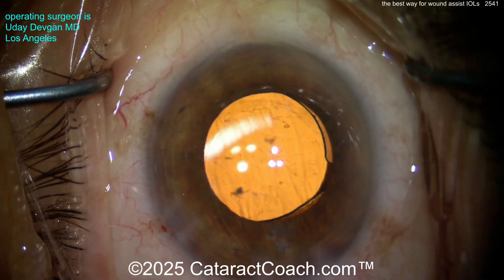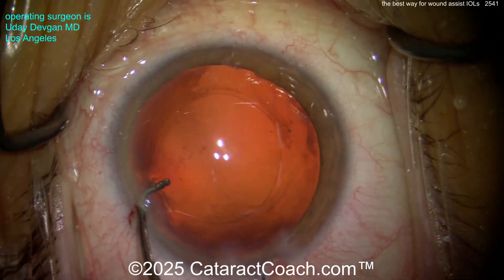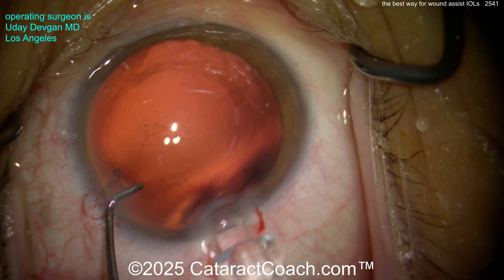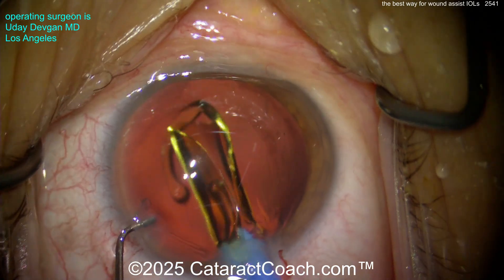Here's another one — same lens, one-handed injector. You can see I'll fixate there with the chopper through the paracentesis. Now you can abut the lens right there, and you don't need the tip all the way in the eye. Again, we're using a wound assist, but now I can get the lens starting to be delivered inside the eye, and the eye has a view the entire time.